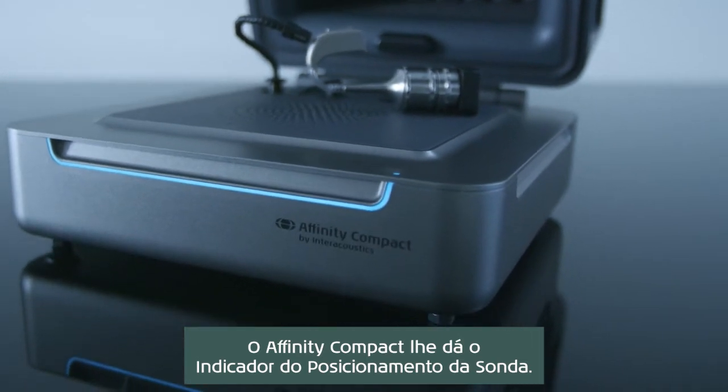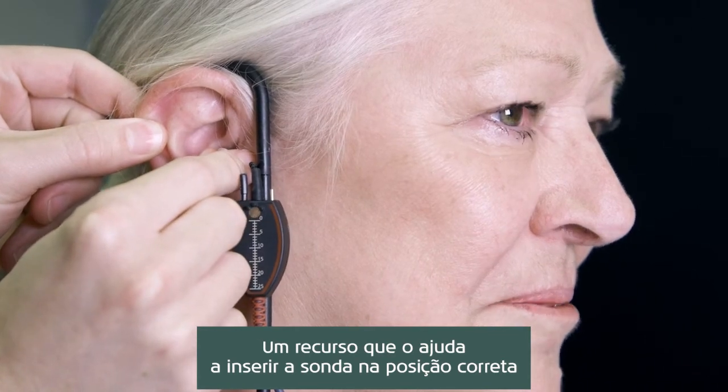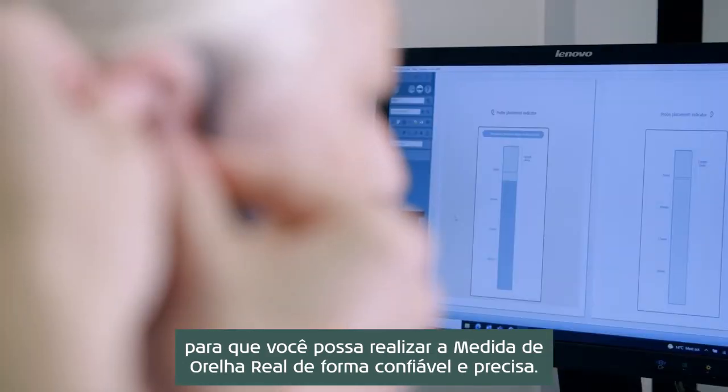Affinity Compact gives you the probe placement indicator, a tool to help you insert the probe tube in just the right position to perform reliable and accurate real ear measurements.